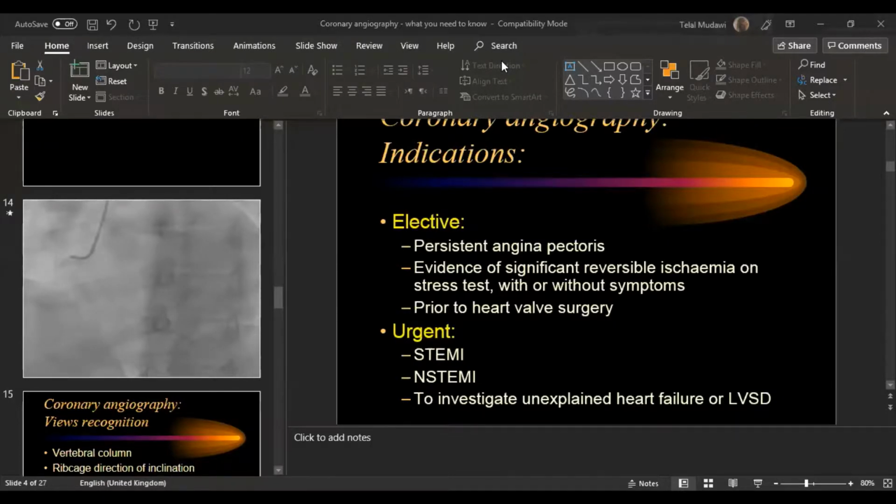بخصوص الvertebral column والposition بتاعه compared to the vessel, again this is mostly true. انا ما ذكرتها لانه sometimes البوزيشن حق الهارت ذاته بيكون swayed باللنكس، والزول مرات بيكون ما قاعد بصوره كويسه في السكرين، فلو اعتمدت عليها كومبليتلي هي موستلي رايت، اوفر 90% اتوقع انها رايت. انه الفيرتبرال كولوم دكتور عبد الرحمن بيقول لو كان ان ميدل والارتري طوالي اوفرلينج معناها ده اي بي فيو، اذا كان تو ذا رايت اوف ذا سكرين معناها this is an LAO view، اذا كان to the left of the screen معناها this is an RAO view. ده كلام صح ما في كلام، لكن ما على اطلاقه لانه في بعض الحالات تلقى لك حالات مجغمسه كده.